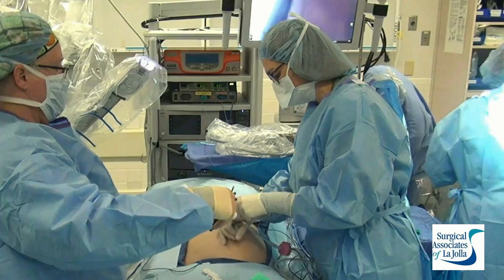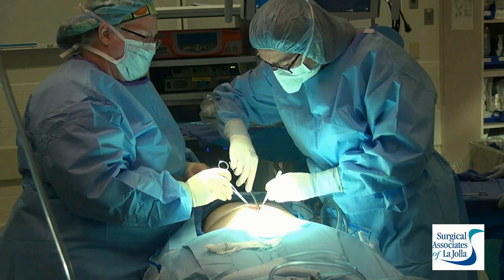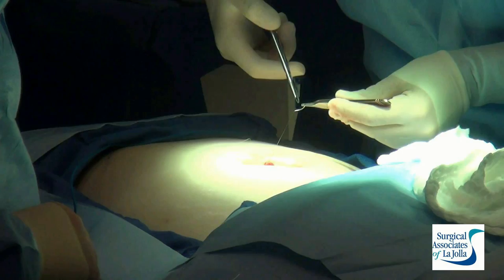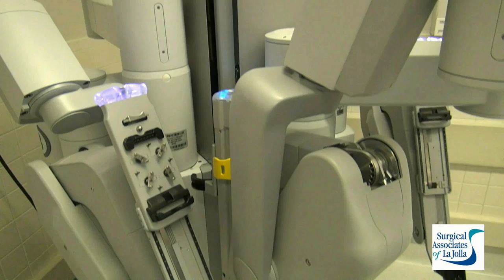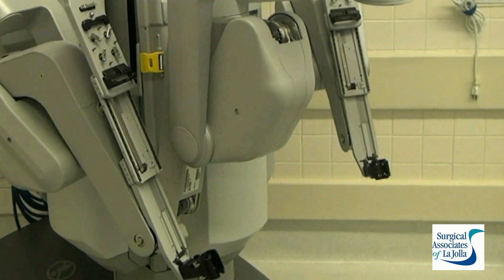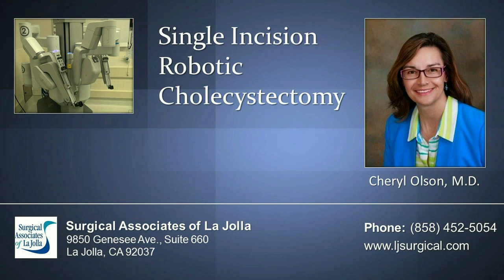This is removing the gallbladder intact through that one incision at the umbilicus, and then we simply close up the fascia — this is a two-layered closure. Here we're returning the skin to its normal beautiful state. This again is our da Vinci, and you can see with the arms the little connections that actually turn circular motions to cause the cables to move, which allows the instrument to move.